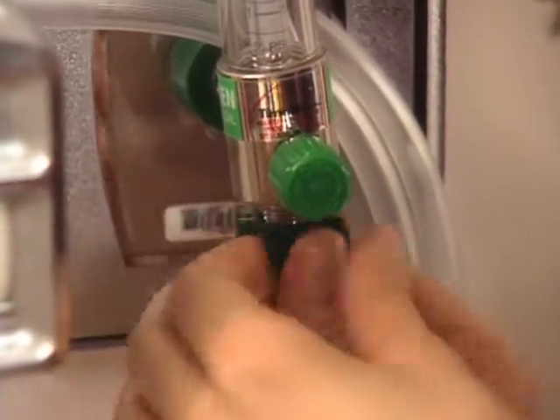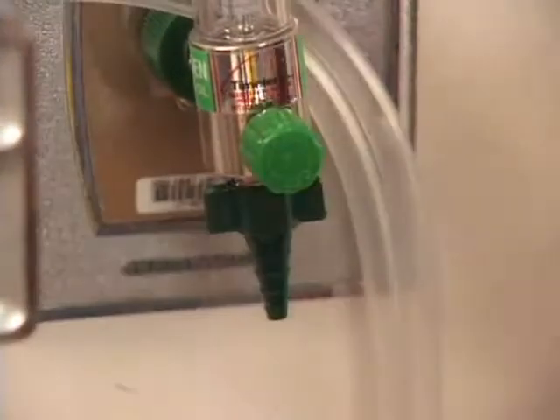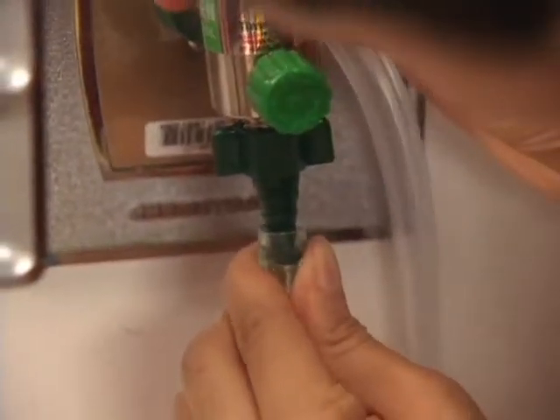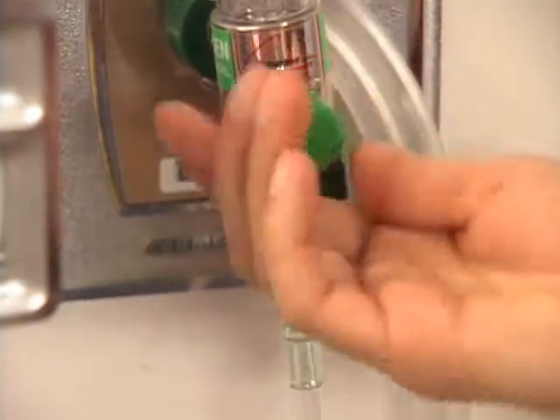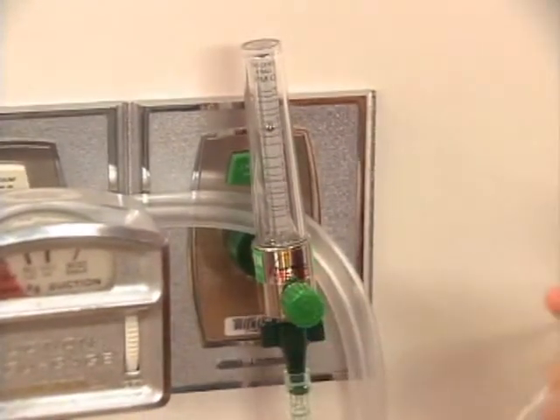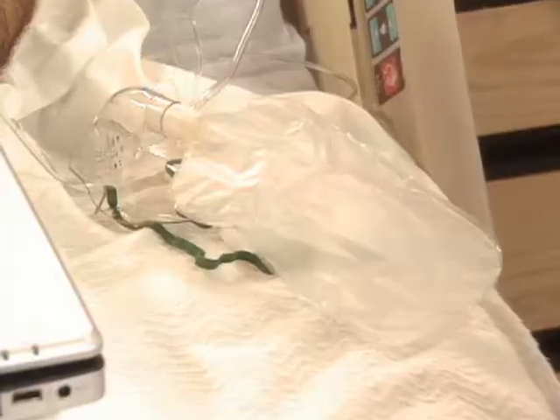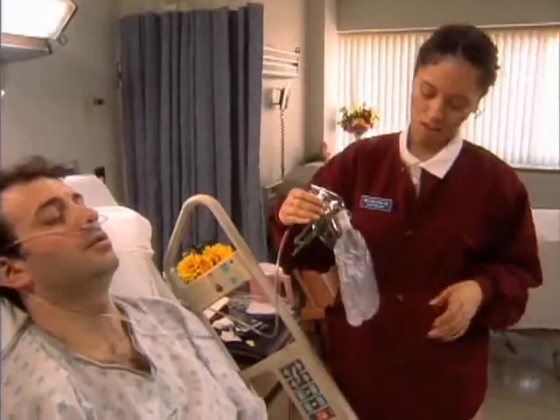There we go. Once you've adjusted the flow rate to the ordered amount, be sure to let the bag fill up with oxygen prior to placing the mask on the patient. Right, of course. All right.